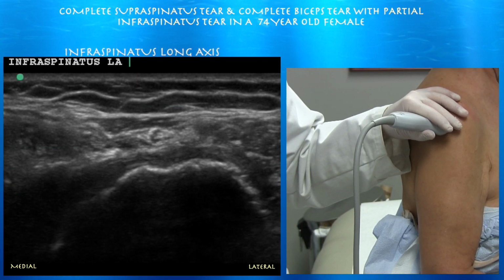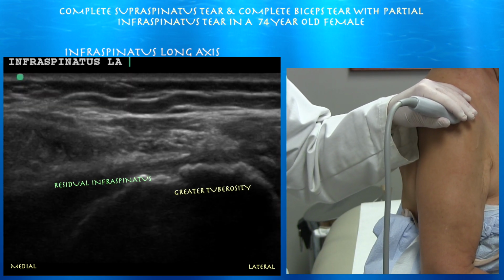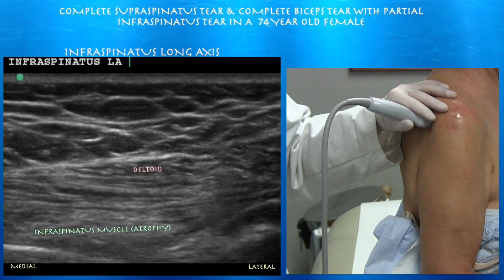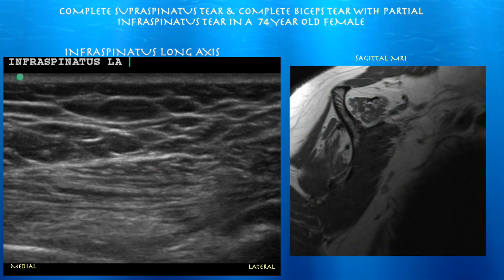And here again we're trying to find our infraspinatus, and again I don't really see much of an infraspinatus. We got the greater tuberosity, really not much of a tendon. Here's the muscle belly. It's a little bit bright, I think, consistent with some atrophy, which you can appreciate on our MRI. And here you can see significant atrophy of both the supraspinatus and infraspinatus muscles. The circles around the infraspinatus muscle.